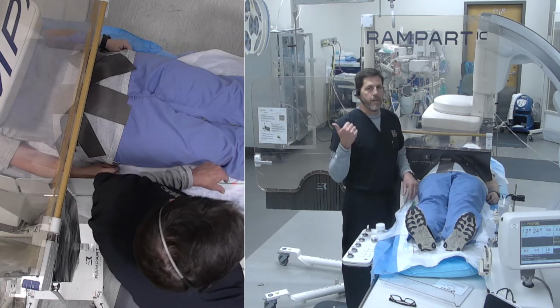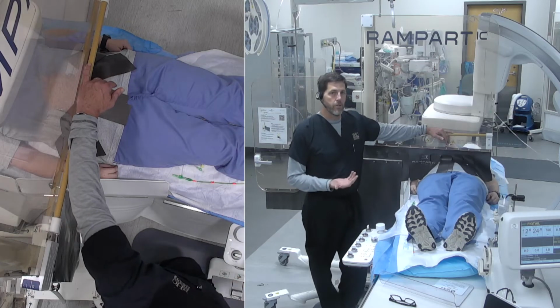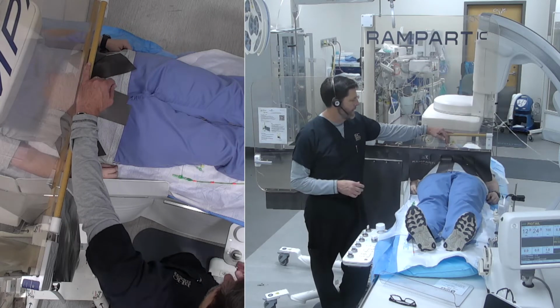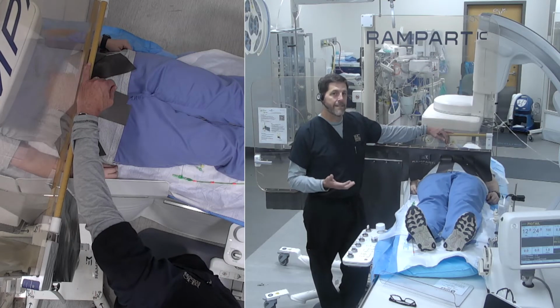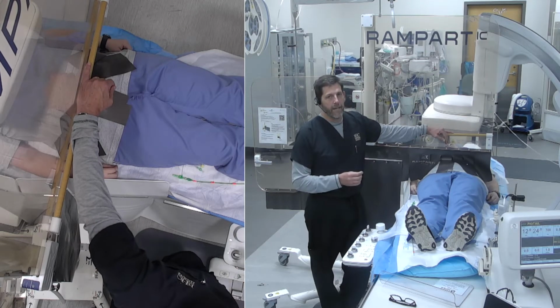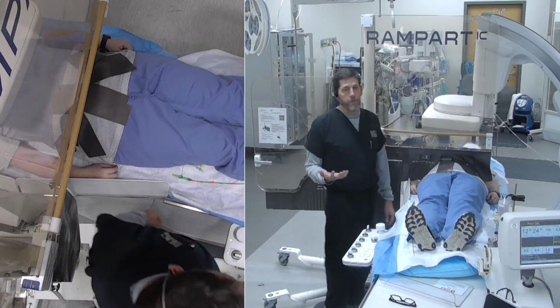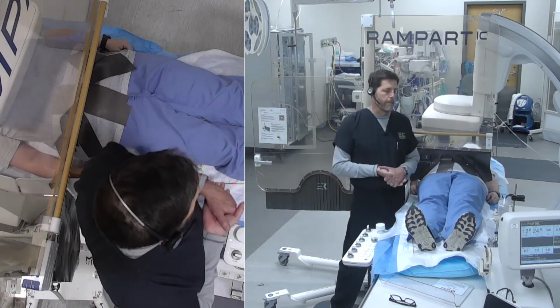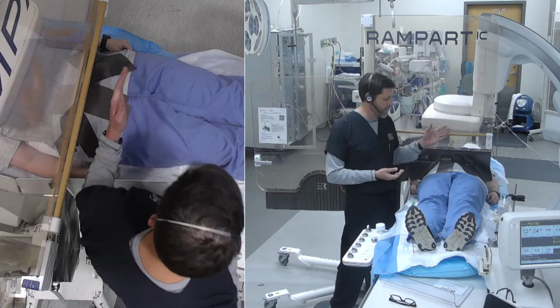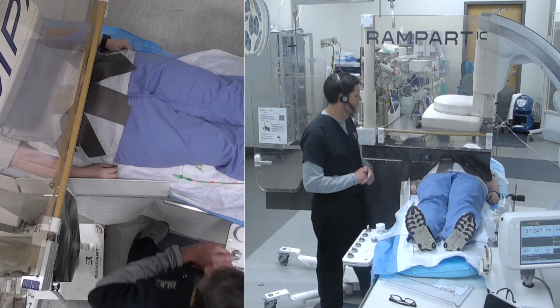All right, so my name is Bob Foster, and I do a lot of peripheral cases and want to show you how to do the peripheral cases based on the access to be able to have multiple sites of access to do your PAD cases. So I'm able to do pretty much all PAD cases from the groin, from a pedal approach. And I want to show you my setup for that.